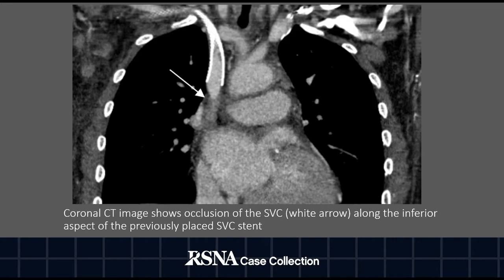Coronal reformat from a contrast-enhanced CT of the chest in the venous phase demonstrates occlusion of the superior vena cava along the inferior aspect of the previously placed stent, as demonstrated by the white arrow.